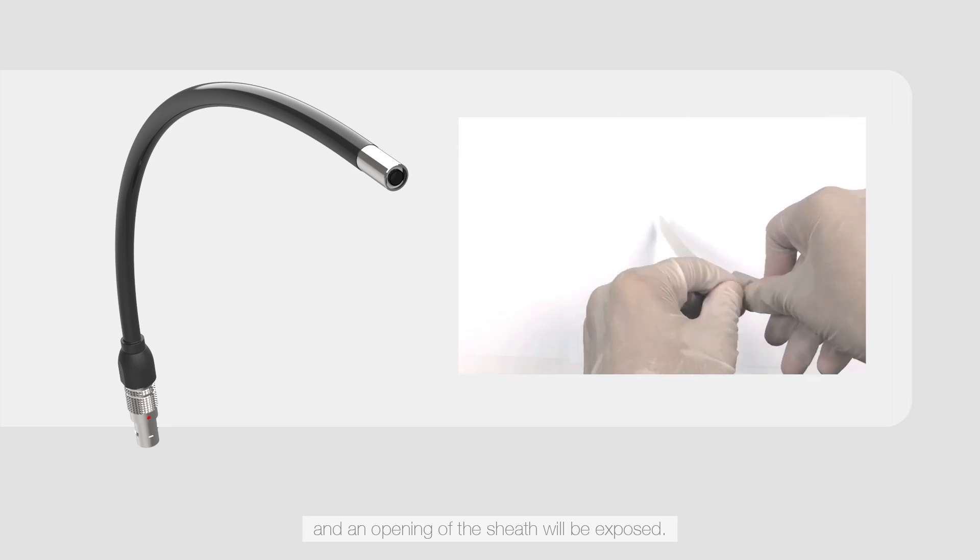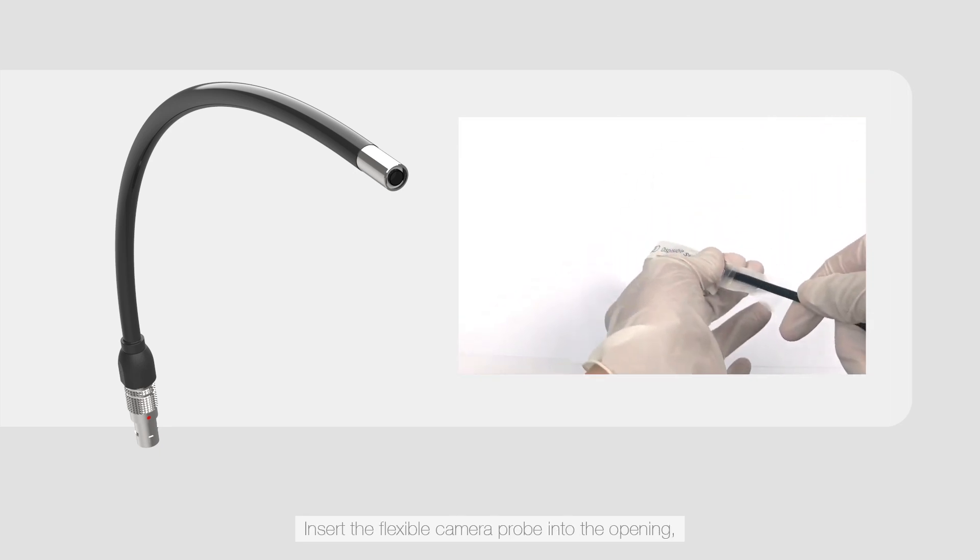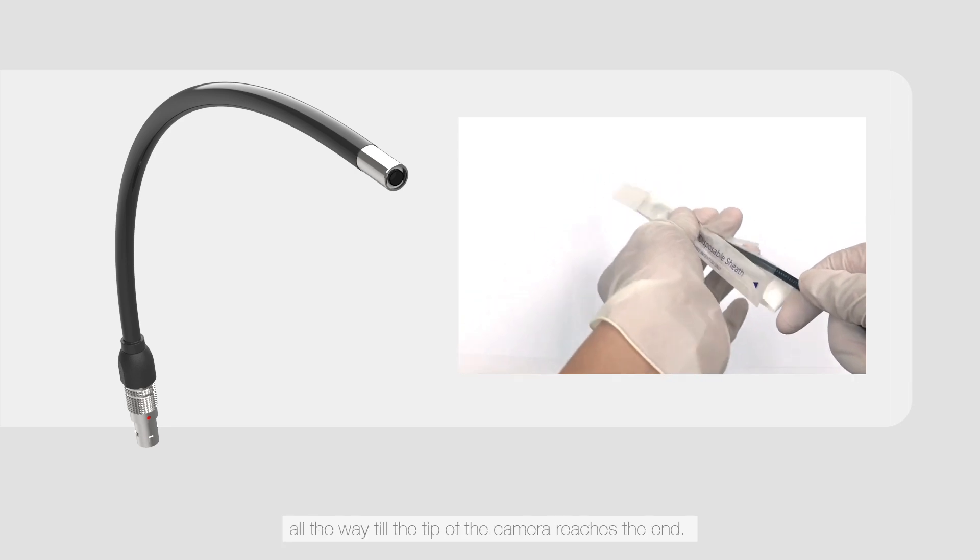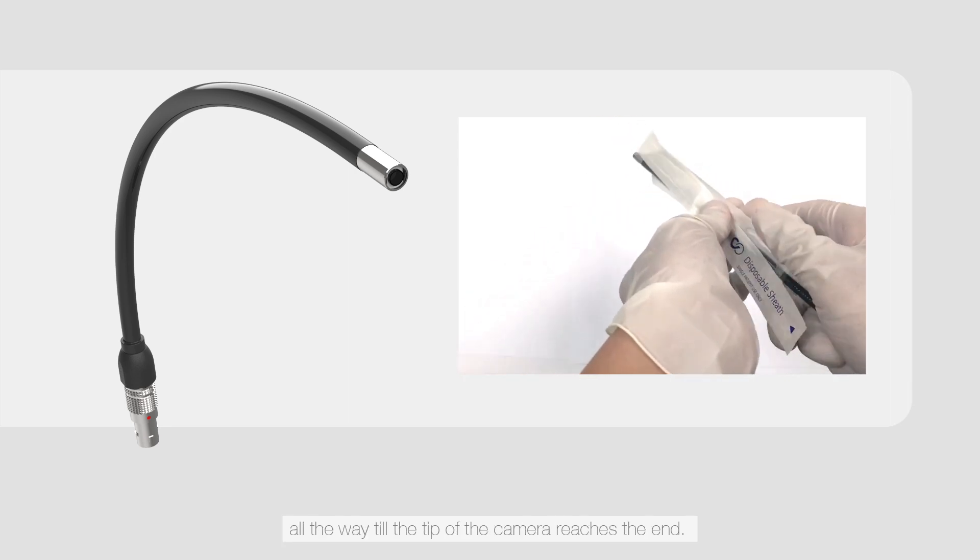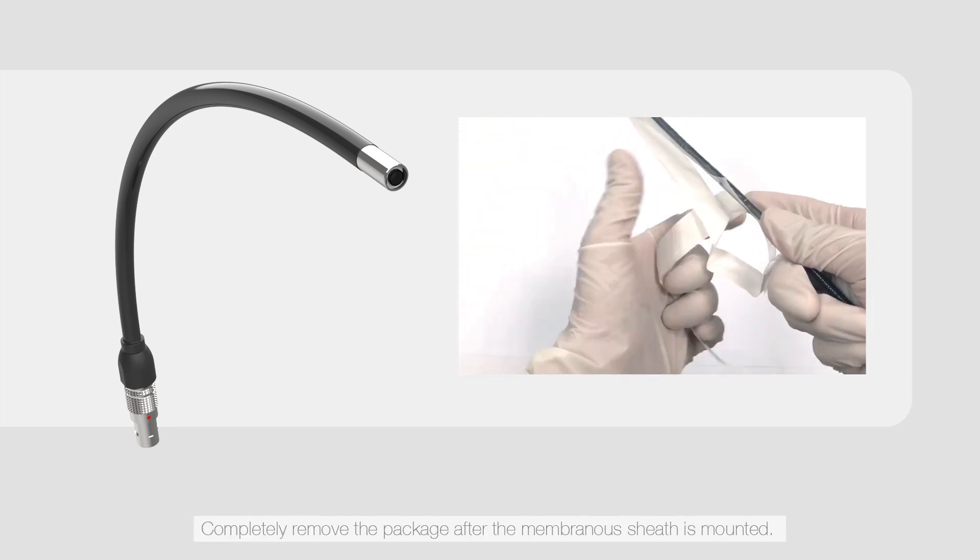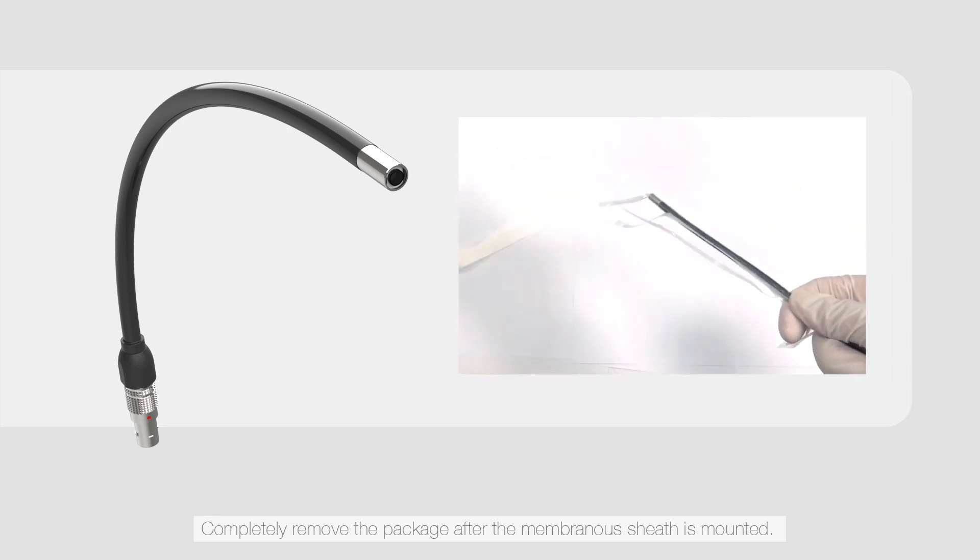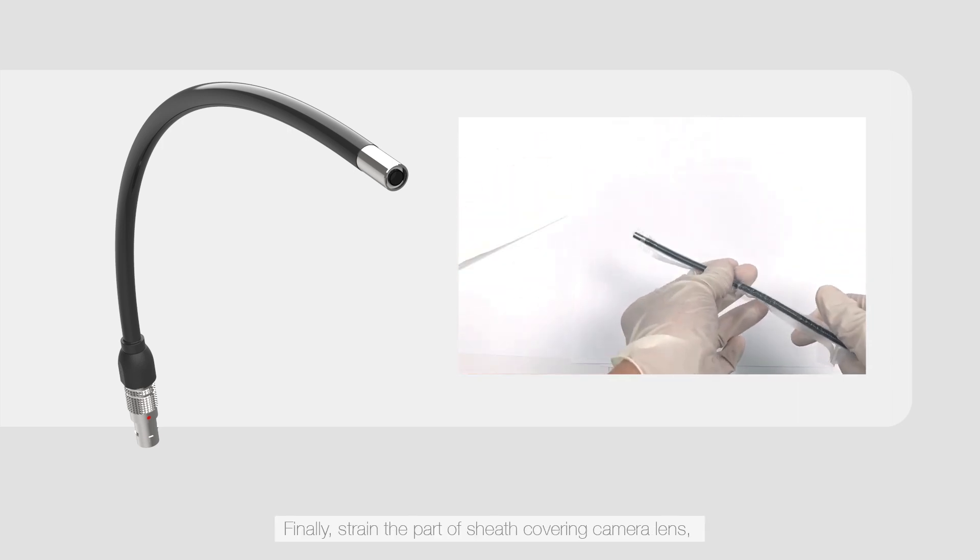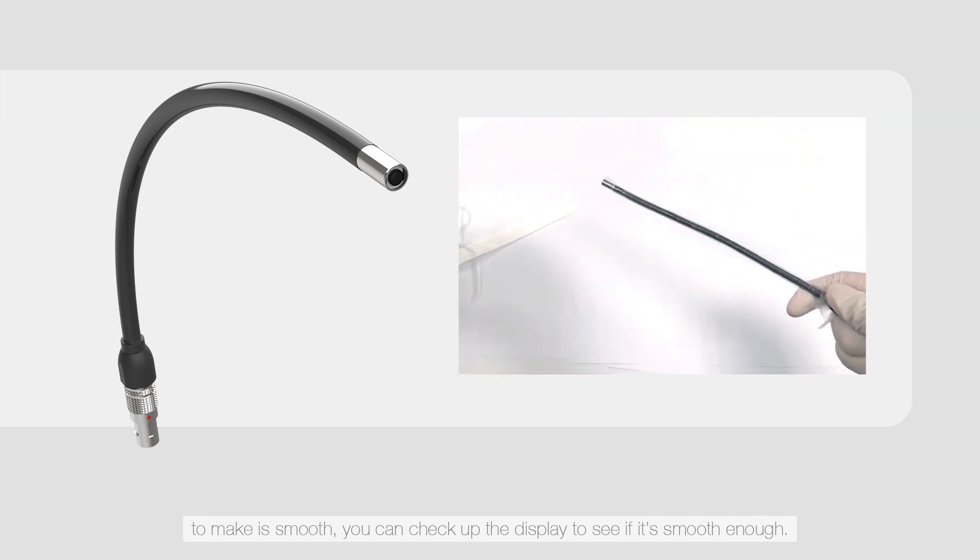Insert the flexible camera probe into the opening, all the way till the tip of the camera reaches the end. Completely remove the package after the membranous sheath is mounted. Finally, strain the part of sheath covering camera lens. To make it smooth, you can check the display to see if it's smooth enough.